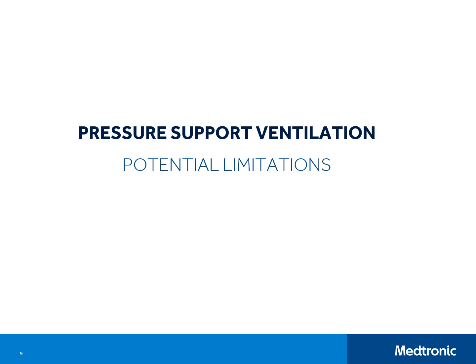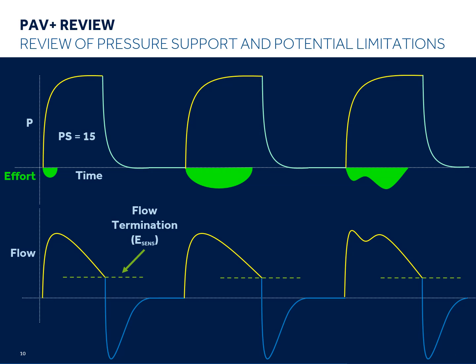In order to appreciate the differences between PAV Plus and pressure support ventilation, it's important to compare the way that each of these modes function. In this section, we'll be reviewing pressure support ventilation and discuss how the respiratory center may interact with this mode. In this slide, we will review the basic operation of a pressure support breath.